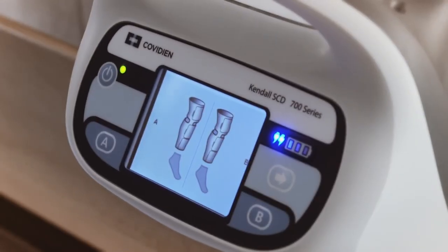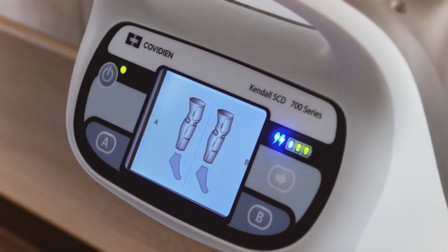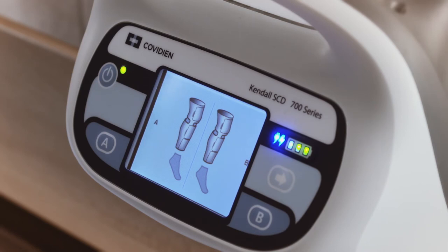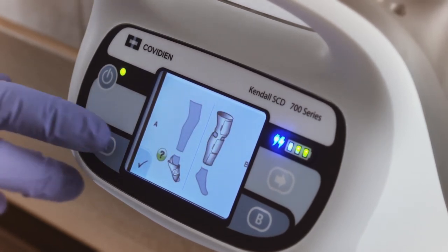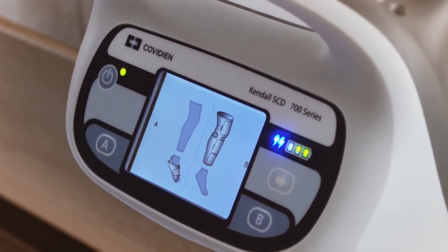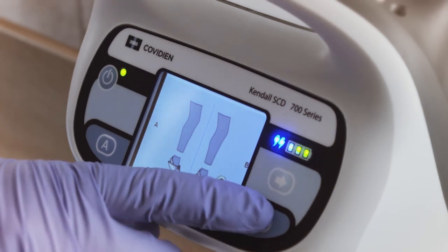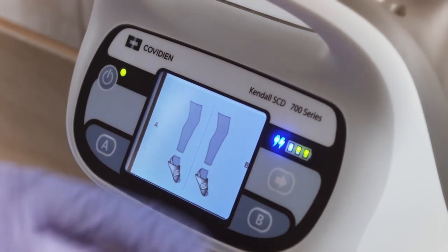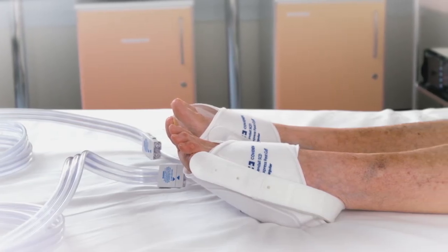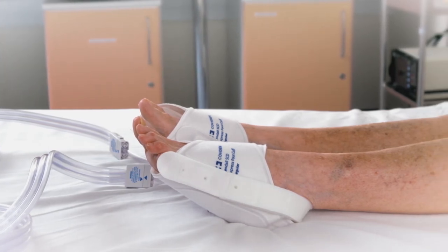During the start-up process, the port A and port B leg images will blink to indicate the default garment configuration, which is leg compression. Pressing the A and/or B buttons will cause the corresponding port's leg image to shift to a foot image, indicating that foot compression is desired. This selection will be confirmed and foot compression will commence once a solid foot icon appears on screen.